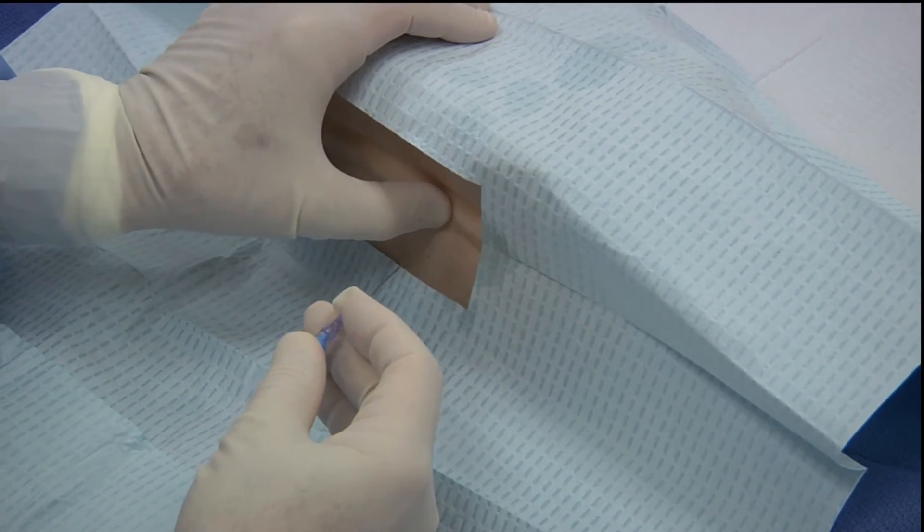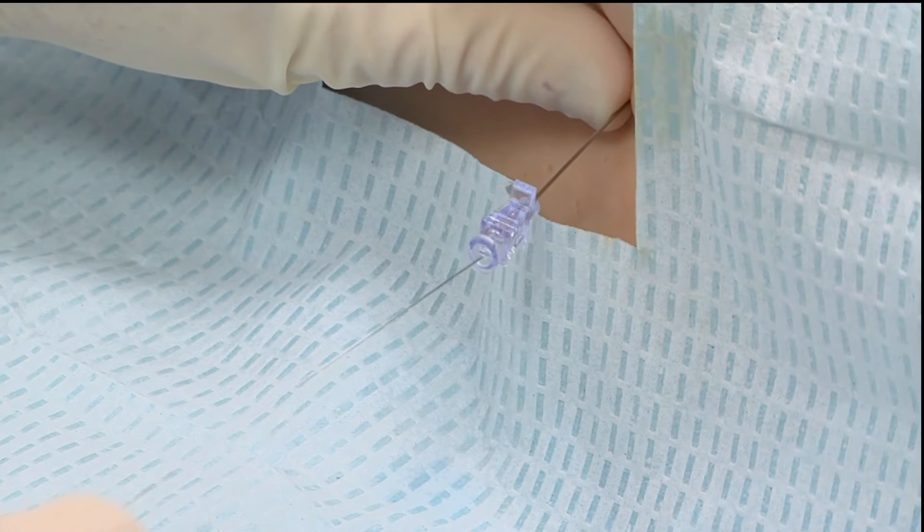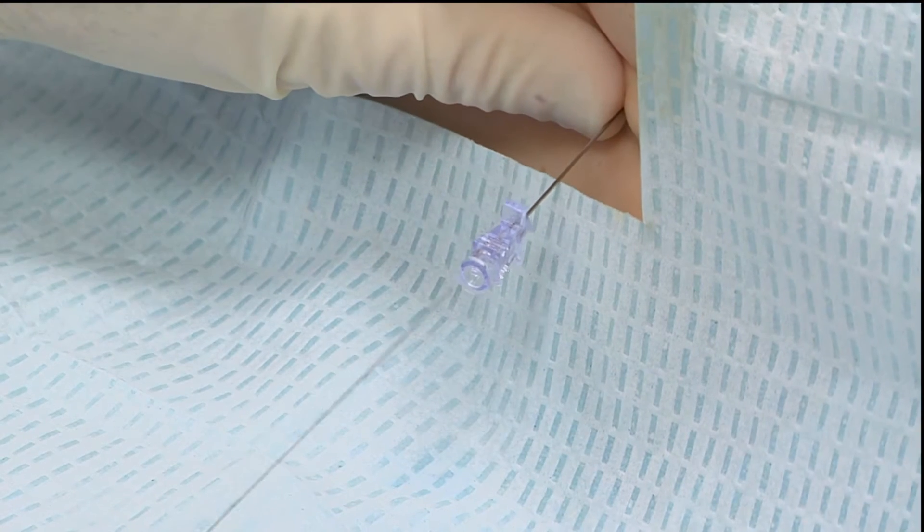We advance the lumbar puncture needle with the stylet in place. Very often there is a slight sensation of a pop when the lumbar puncture needle passes through the dura and into the CSF compartment.